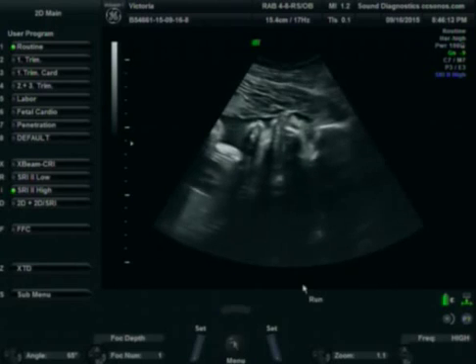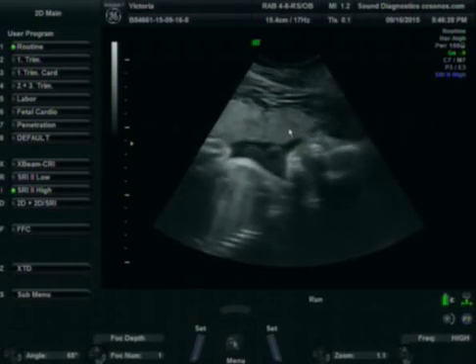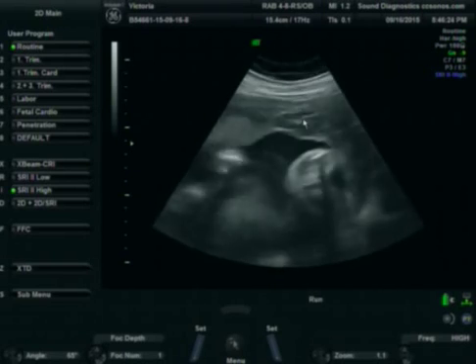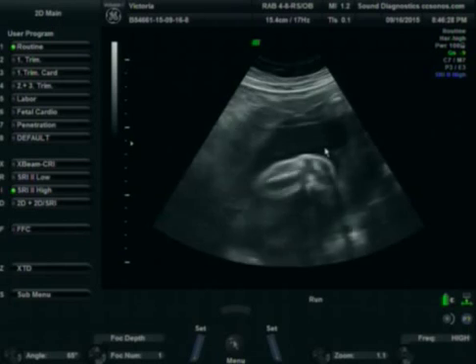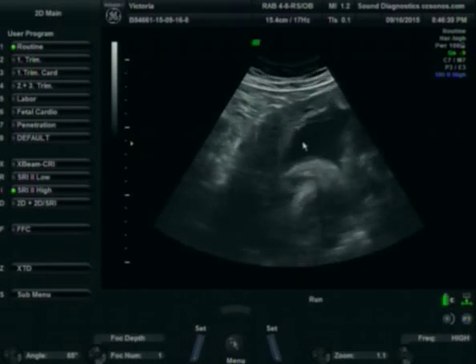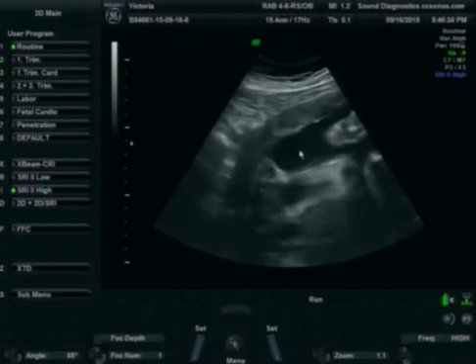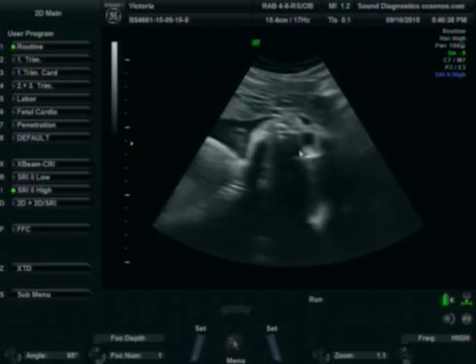So you see here in 2D, there's very little darkness around the front of the face. The darkness would be the fluid. So you can see the placenta and the uterus all kind of, the nose actually getting smushed right there. If I come over here by the baby's butt, it's not too bad. There are some nice pockets of fluid over here. So she's just positioned wrong. Yeah. The baby decided to have all the fluid down by the feet instead of in front of the face.